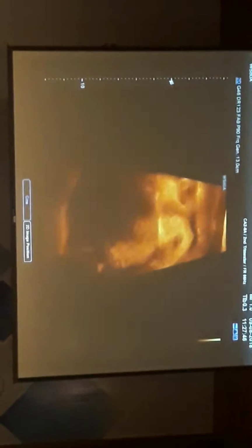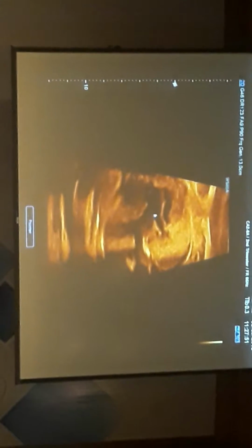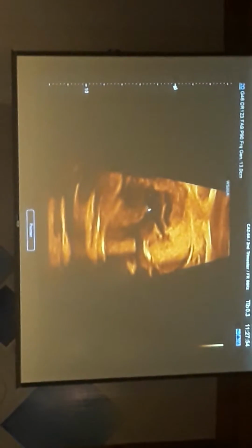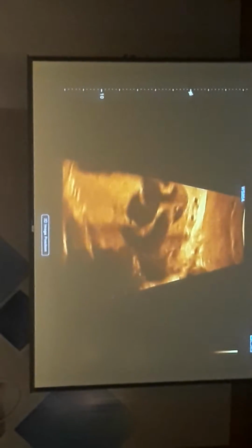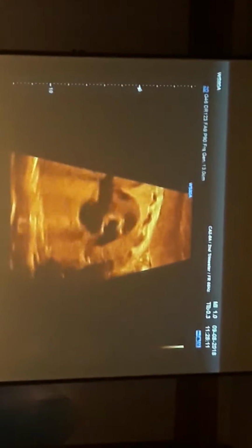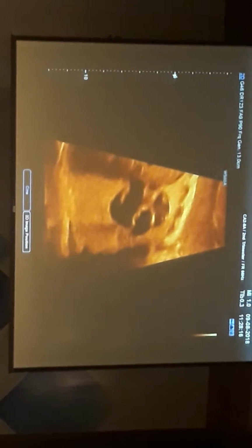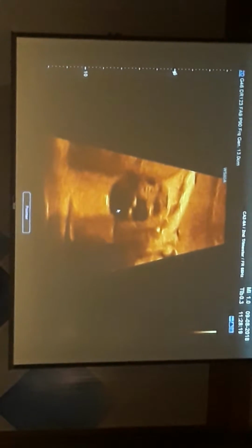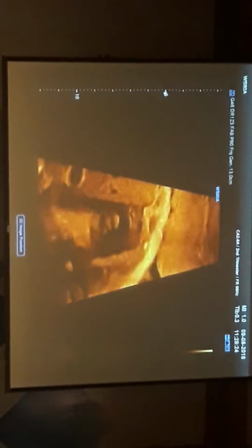So here, it's able to show, it looks like this vessel bifurcates, probably the pulmonary artery, probably the aorta. You can start to see, sometimes we can see the coronary arteries. But let's look at the arches.